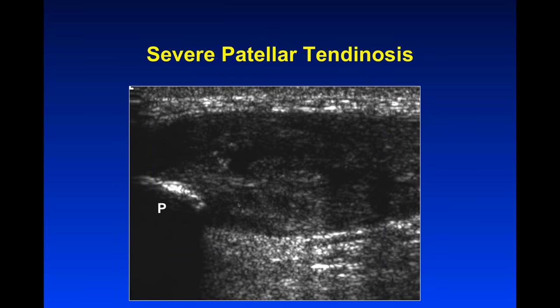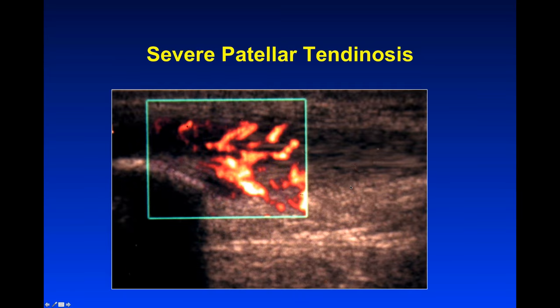Sometimes tendinosis can get really severe, as shown in this patellar tendon below the patella. It's incredibly thick and heterogeneous, with even interstitial tearing, very heterogeneous and hypoechoic with all the flow as well. These conditions really can be very difficult to treat.